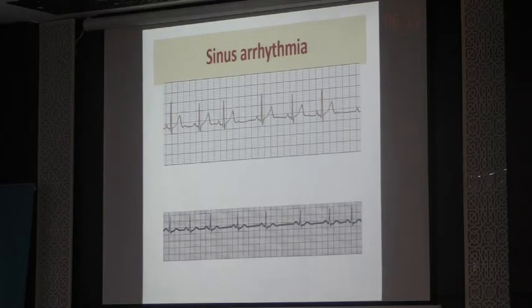This is a sinus arrhythmia. We find RR irregularity, but it is a sinus P followed by QRST, with pauses or prolongation here. So we know this is sinus arrhythmia and it is present in children, and in some children it is very marked, to the point that the pediatrician listening by auscultation hears it as dropped beats and gets alarmed and sends the child for an ECG.